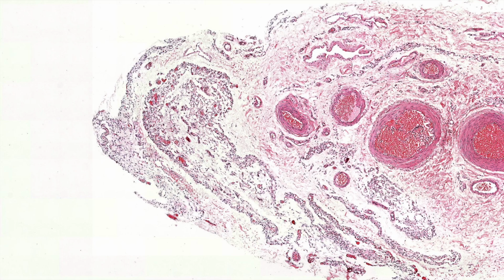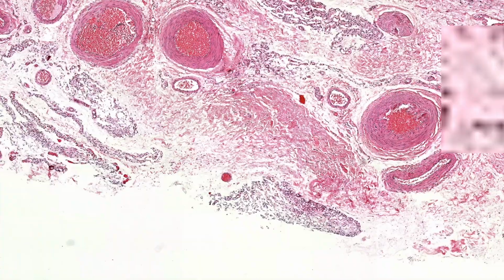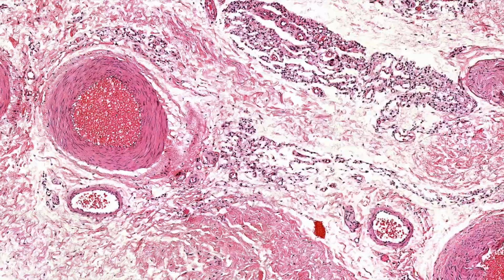And particularly for pathologists watching, in the GI tract, if you see this in the omentum or some of the fat around the GI tract, it certainly can make you think more of a signet ring carcinoma. So don't be afraid to use a keratin if you have any doubt.